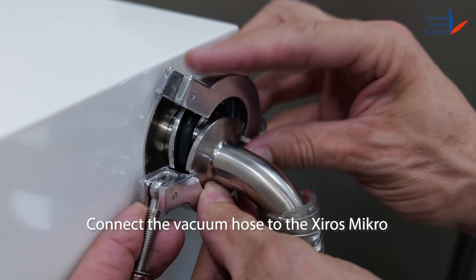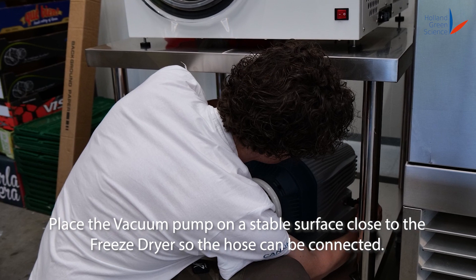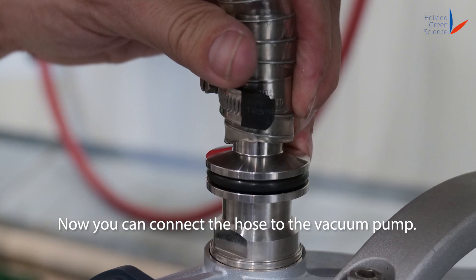Connect the vacuum hose to the Xiros Mikro. Place the vacuum pump on a stable surface close to the freeze dryer so the hose can be connected. Now you can connect the hose to the vacuum pump.